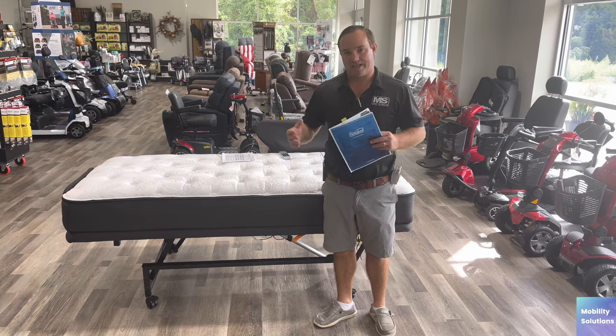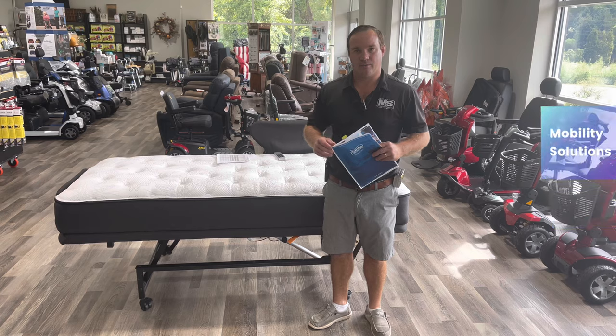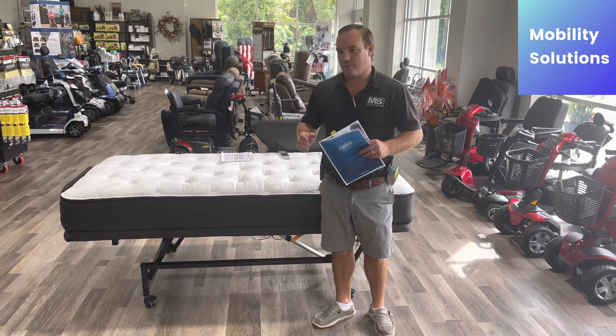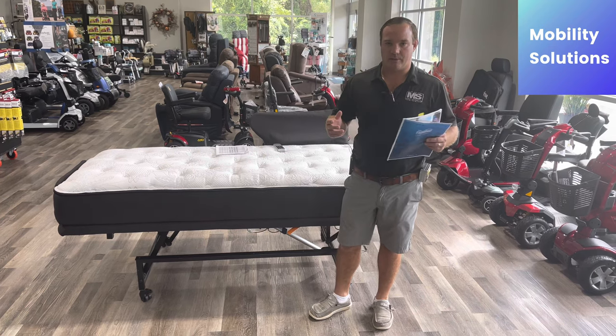A lot of people are ordering hospital beds. Hospital beds are just basic — you can get them at all different prices, really affordable. It really depends on what you get: a residential bed or a long-term care bed. Sometimes we get long-term care beds in residential houses.